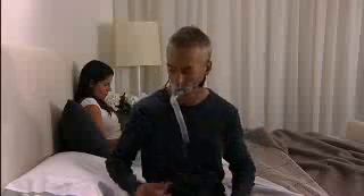After fitting your mask, turn your CPAP on, then attach the tubing to your mask.